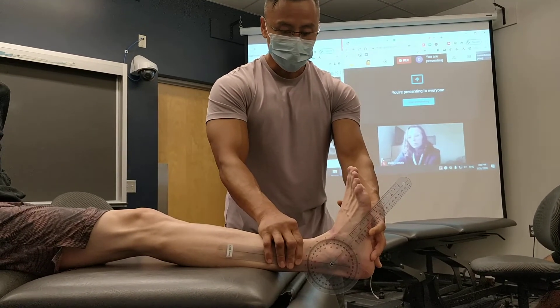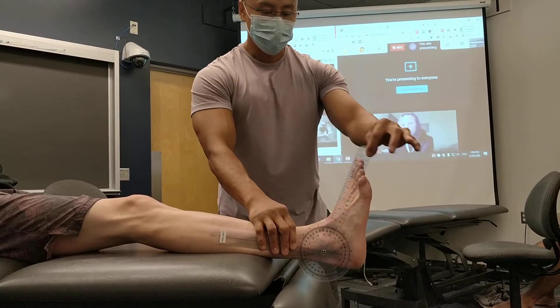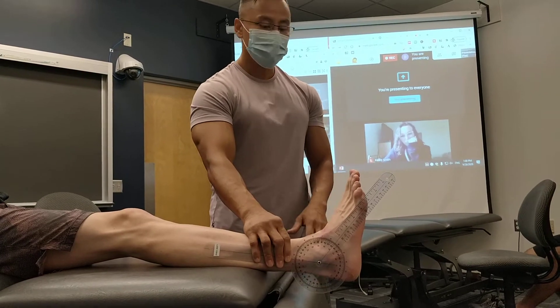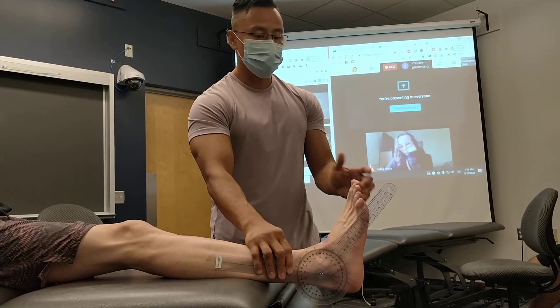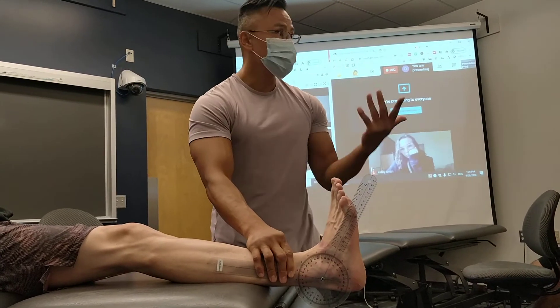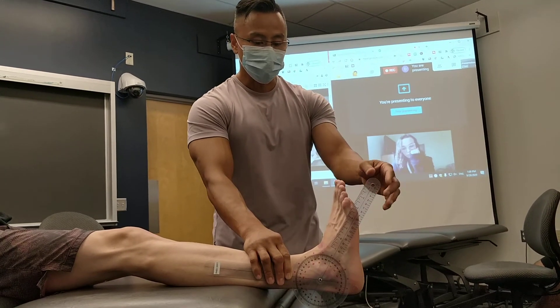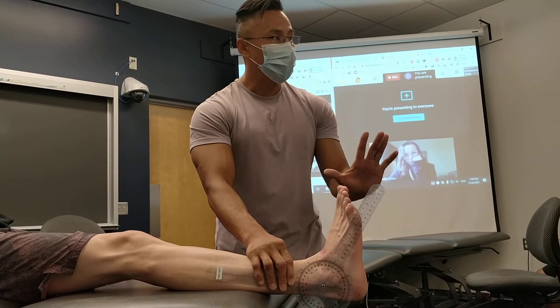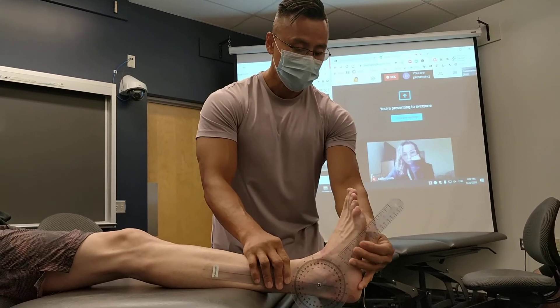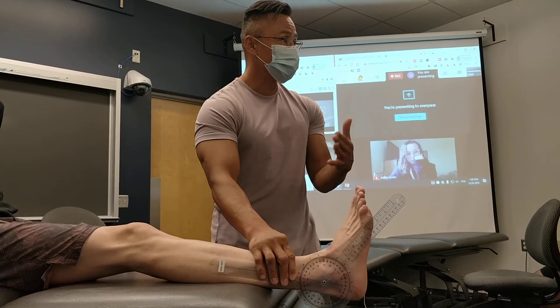But when we started, it may not say zero because we went from 90 degrees to — let's say 30 degrees. So let's say 30 degrees is the new zero. Patient dorsiflexes and now it moves 15 degrees — 15 degrees is your dorsiflexion. So similarly, as long as you go back to the zero — the original number — and you can keep it on the base of the fifth, as long as you remember what that starting number was, because that is the adjusted perpendicular.